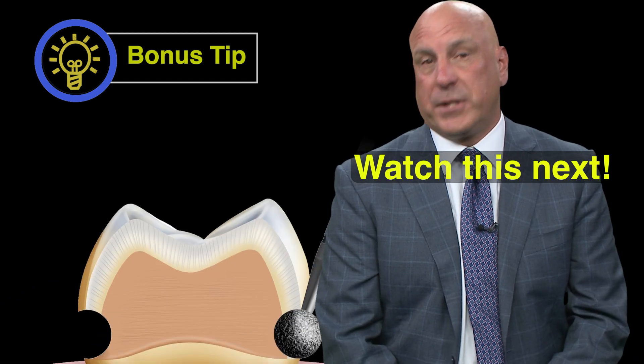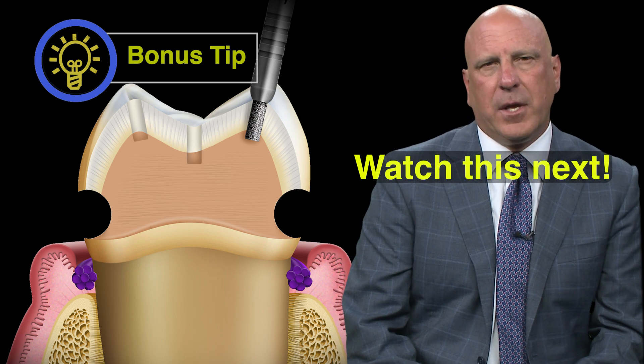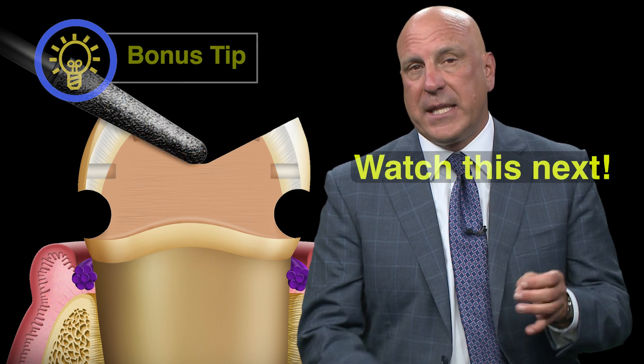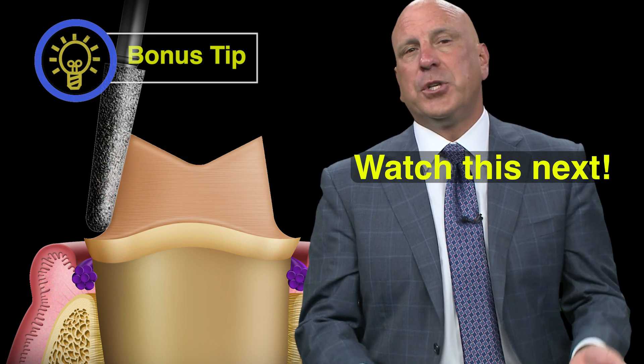The prep technique for a posterior tooth — all those steps are exactly the same as they were on the anterior tooth. In fact, let me suggest that you try this for the first time or two on a posterior tooth. That's how I learned to do it.